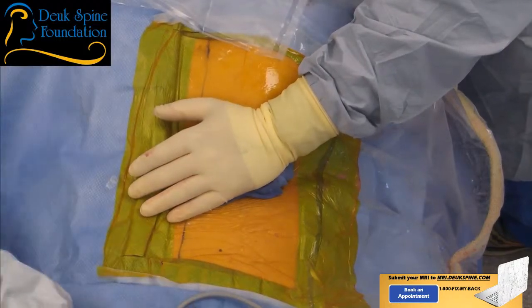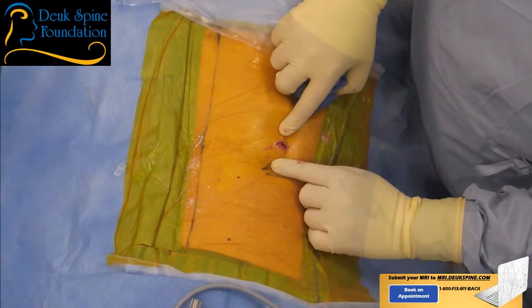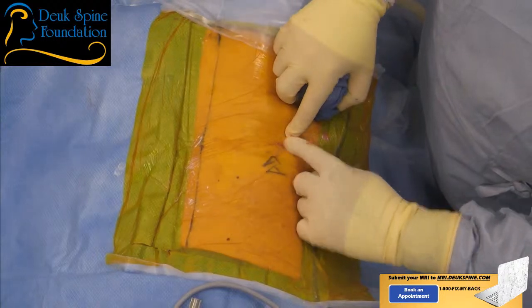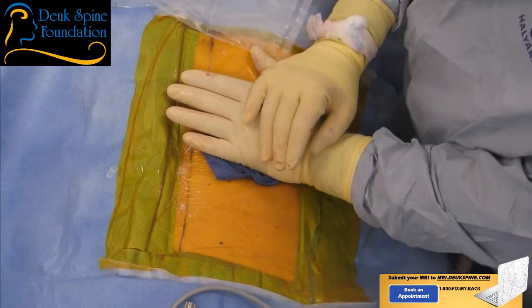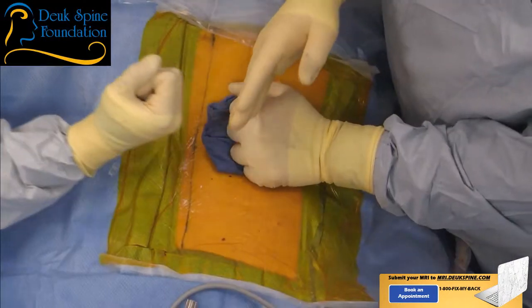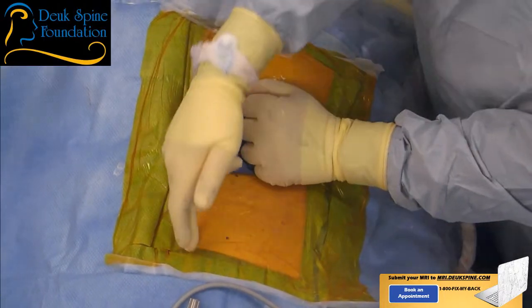So thank you, everybody. Let's show the incision. It's pretty remarkable. We fixed 3 disc herniations with probably a 9 millimeter, maybe a centimeter incision this time. It's a little bigger than normal, only because I had to try to get a little more medial to get to 3-4. One of the secrets is the higher up the spine you go with discs that you're fixing, the more medial you need to start. Okay, so it's like that. This is the midline here.